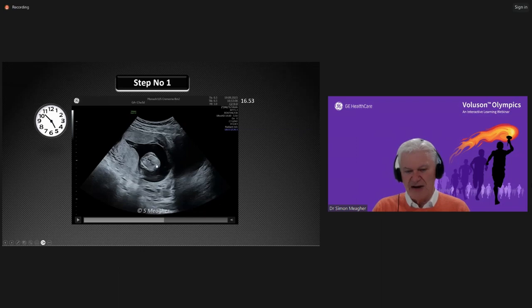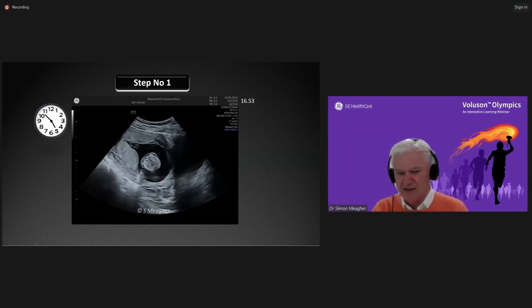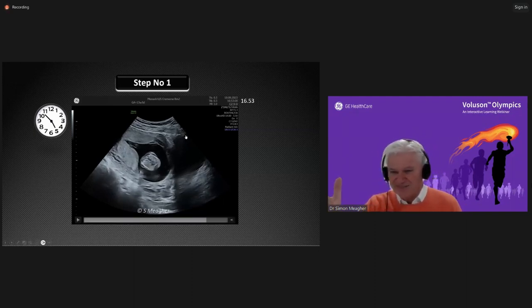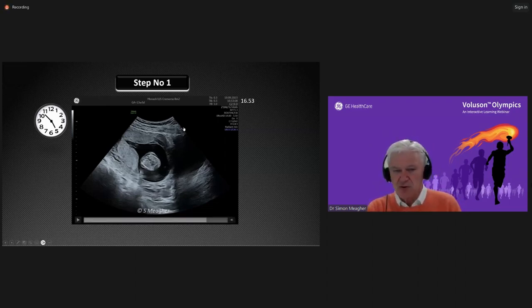But if you look at that heart, it represents maybe less than 1% of the entire canvas of imaging I have available. And it's a shocking image because the baby's in a terrible position and there's no magnification, there's no optimization. So what do I do? Do I give up and say, oh, look, I'm not going to be able to see the heart and go home? I say no. The first thing is I select my transducer, a 2 to 9 megahertz transducer. I will reduce my sector width.